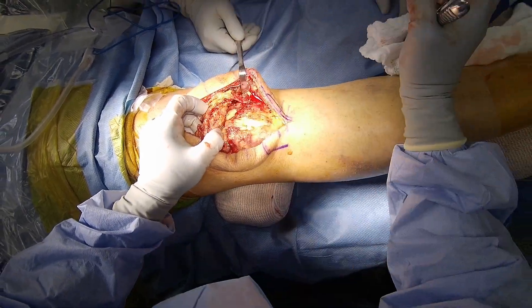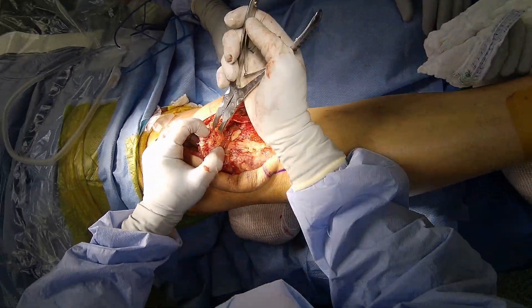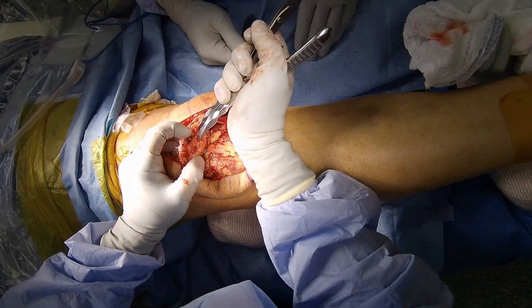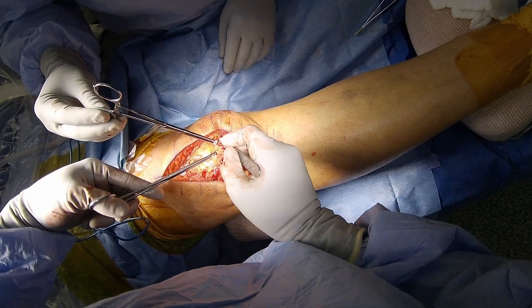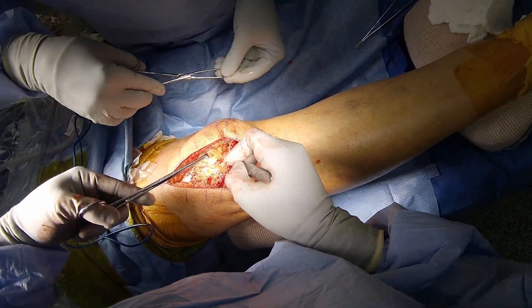I know that I can take a reasonable amount of bone because I want a large surface to heal, and this should be quite tight as these patients tend to have a knee extension lag anyway. I also prepare the patellar tendon to remove any bone fragments and have all the ends clean and healthy.